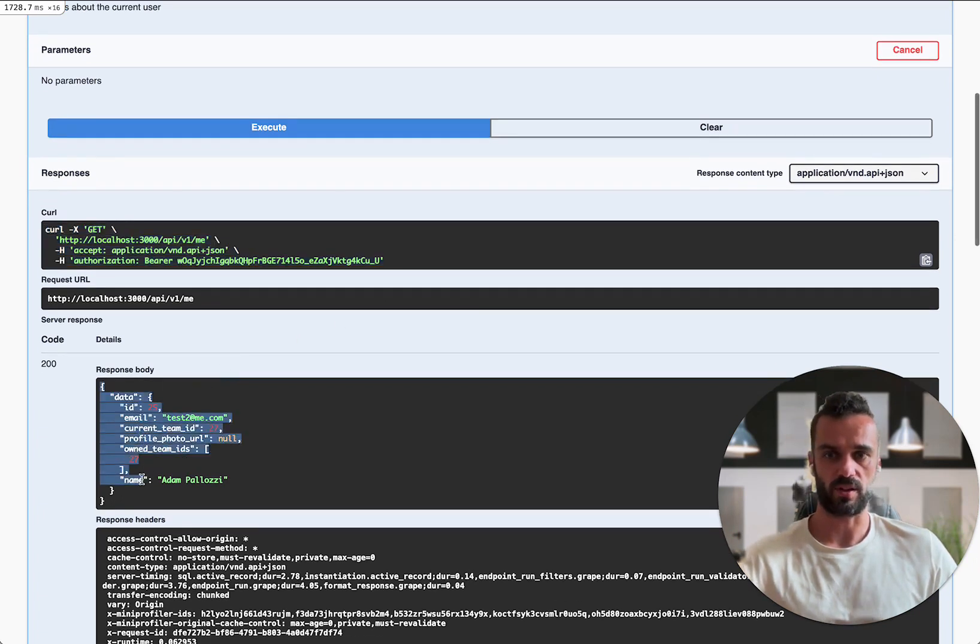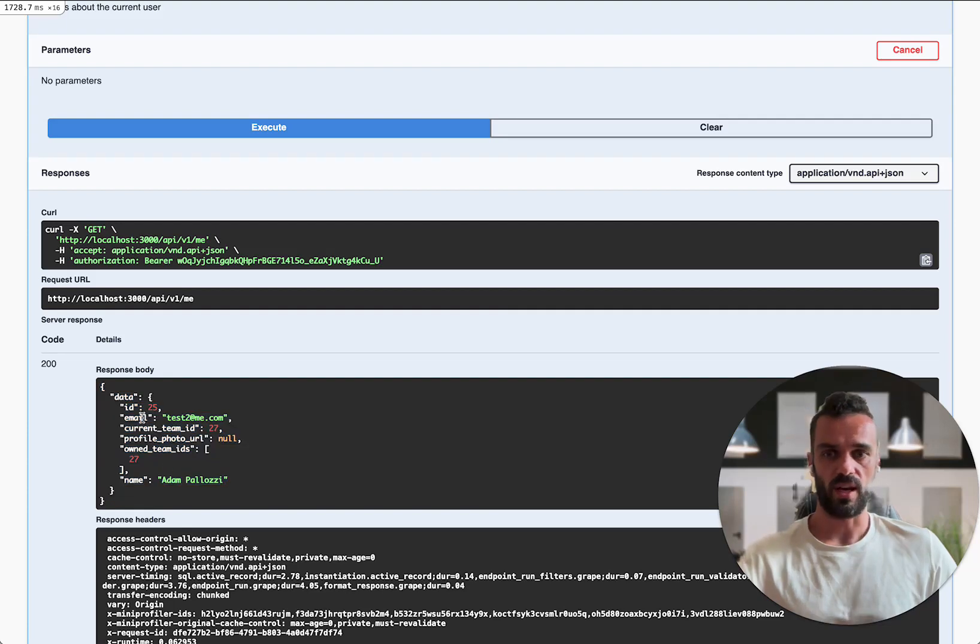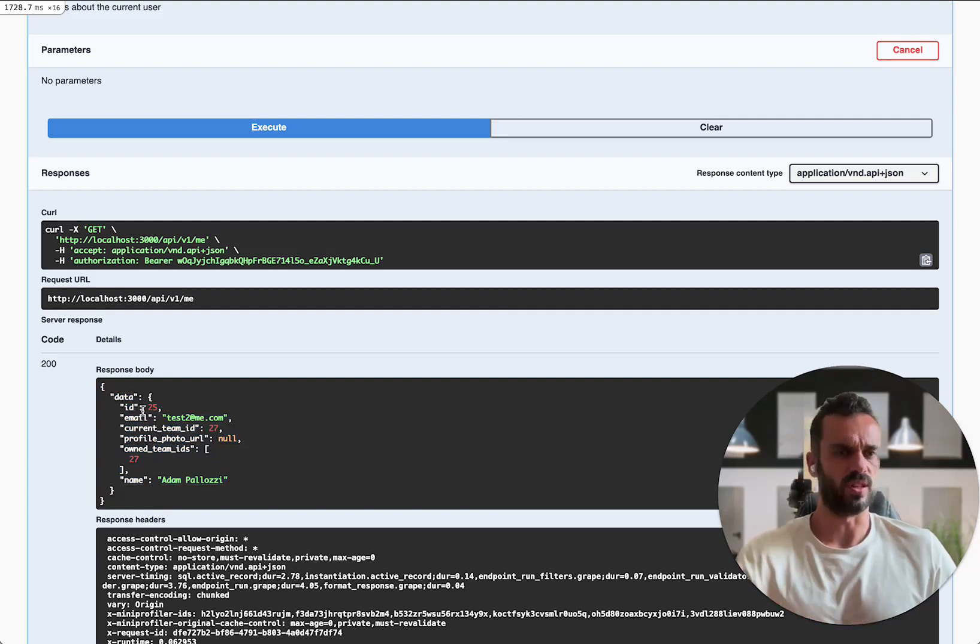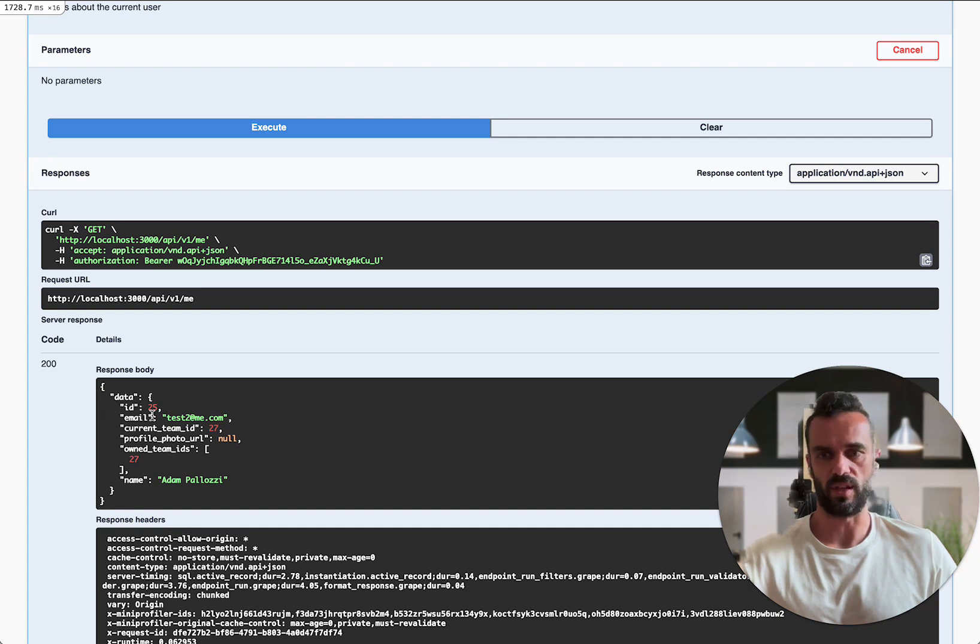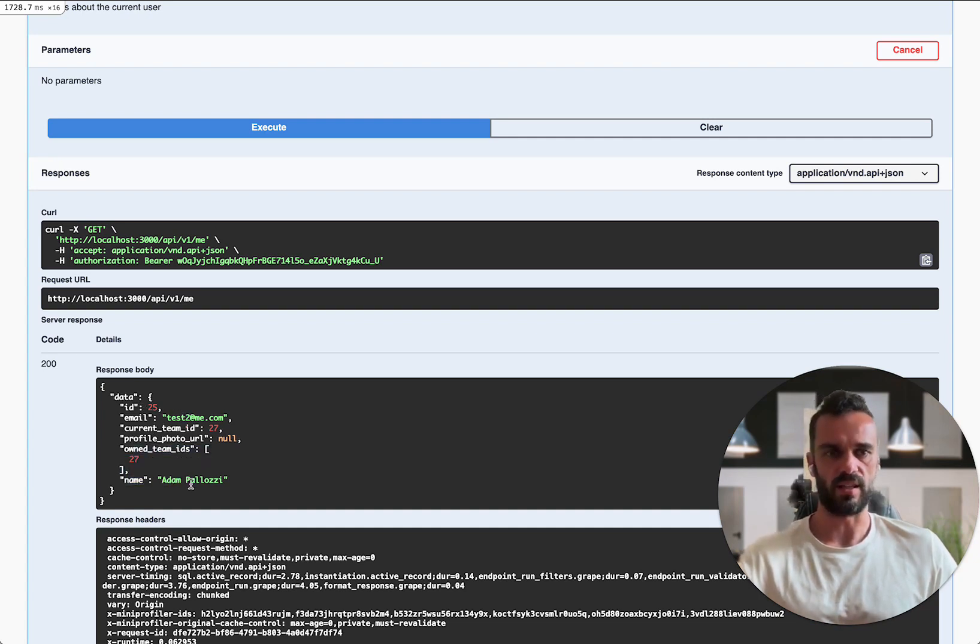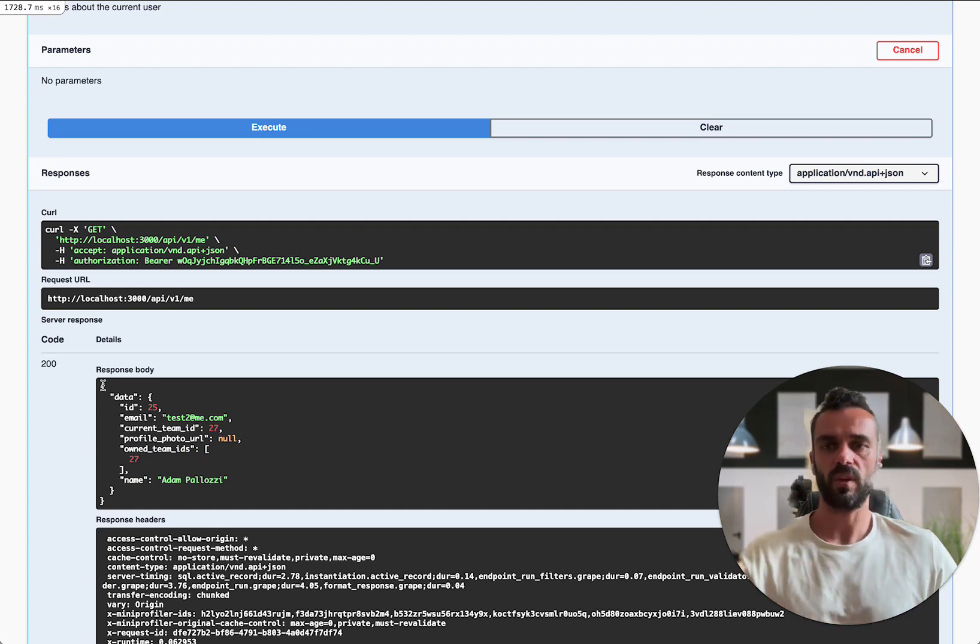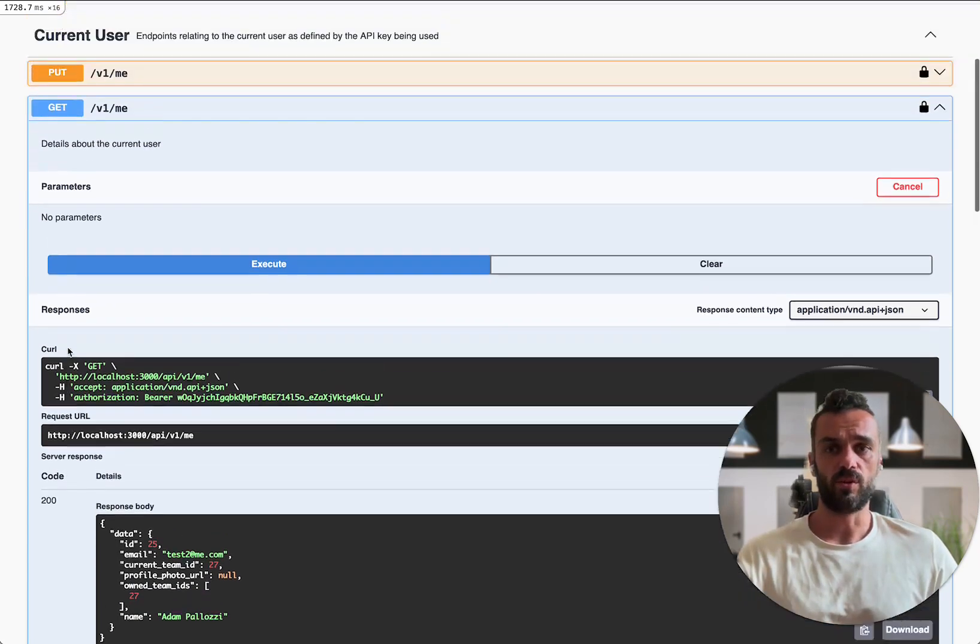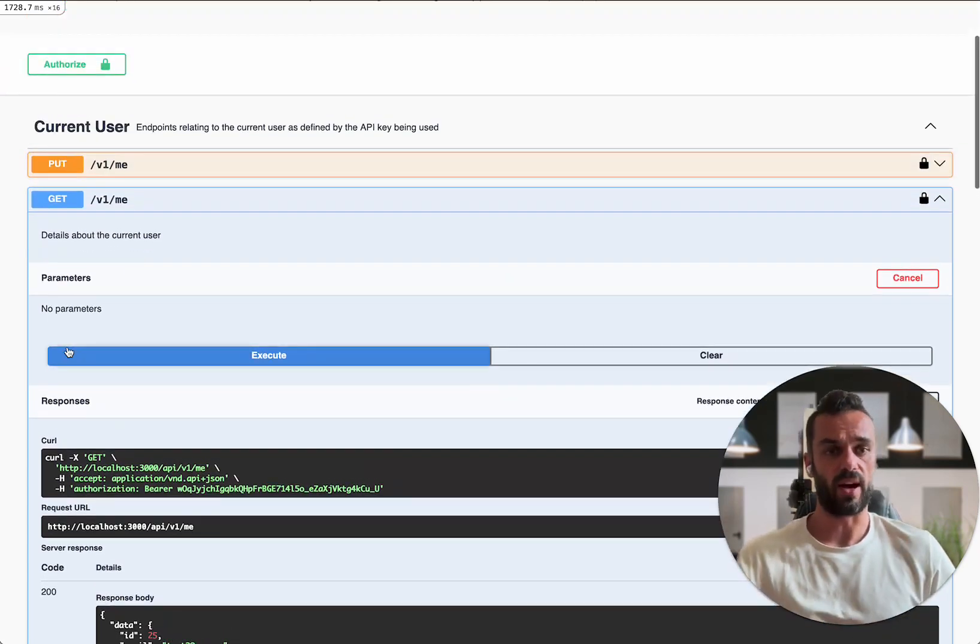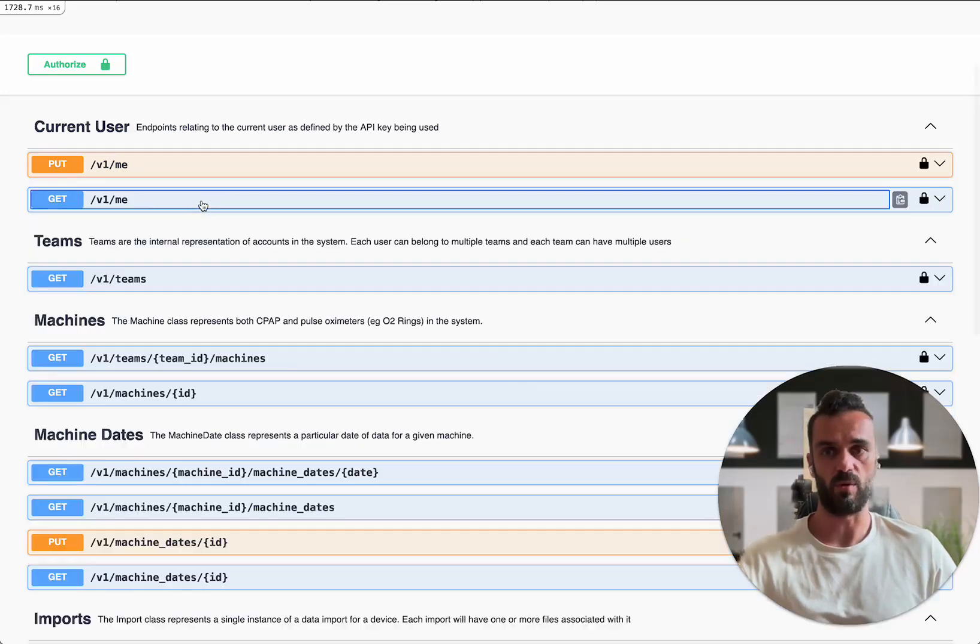And then here's the response that I got. This is the real live response about the user that I'm logged in with or the user that owns that API key that we're using. It's giving me the email address and team IDs and names and all that sort of stuff. So that's just a really simple example of showing you how you can use the interactive API endpoints.